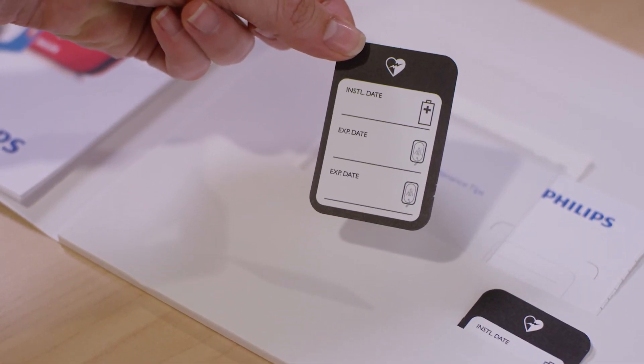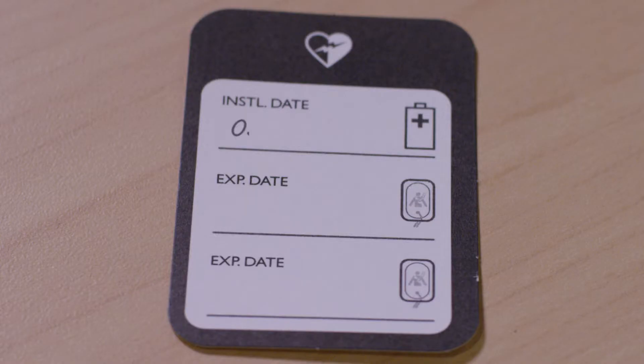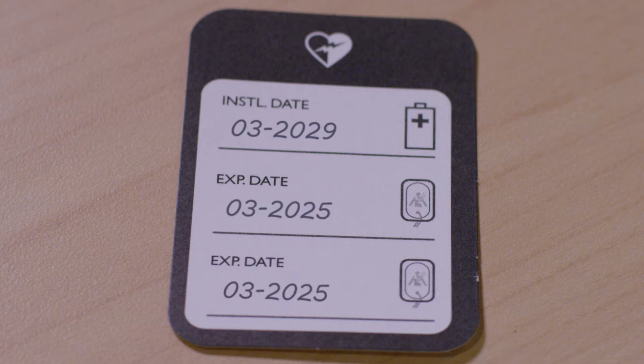On this sticker, write down the key dates for your accessories: the install-by date for your spare battery, and the expiration date for your pads. Keep in mind that the date on the battery is not an expiration date. It represents the latest date the battery should be installed into the device in order to ensure full battery life.